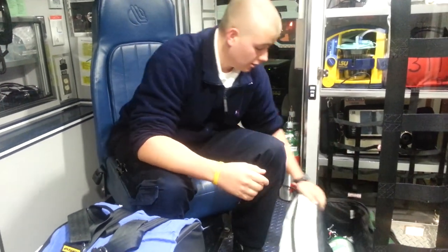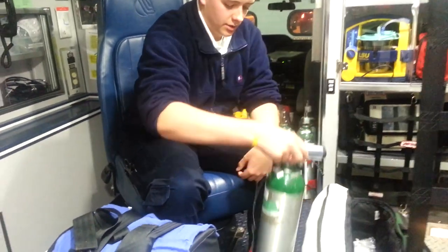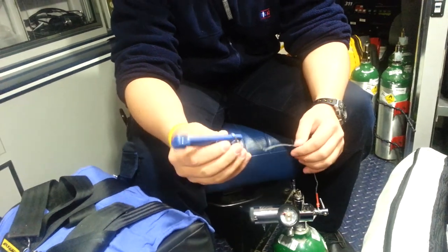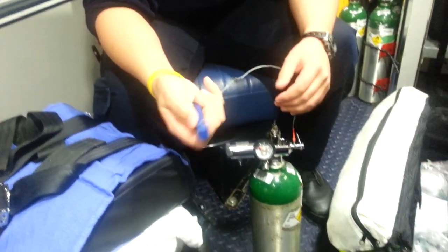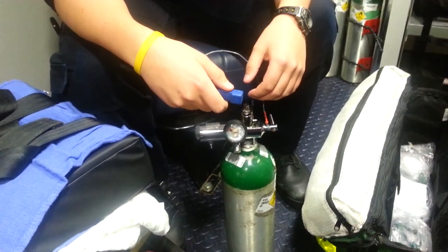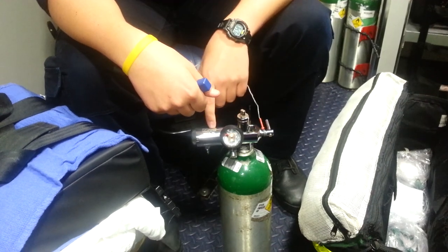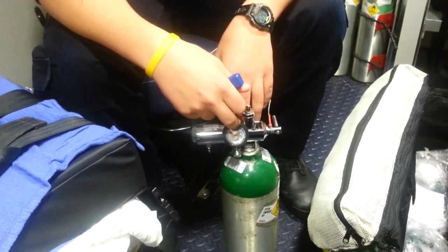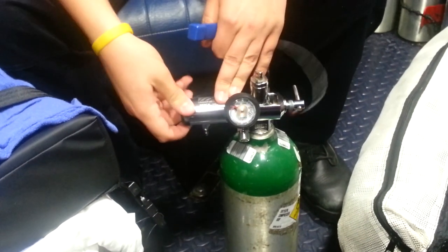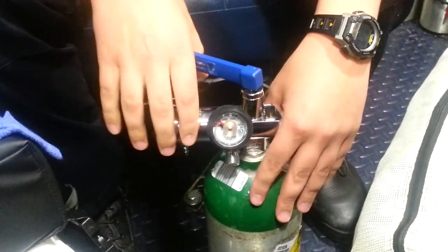So the first thing I check out is the oxygen tank. When you check out the oxygen tank, most of them have what's called an oxygen wrench attached to it. It's a wrench used to open up the oxygen tank so oxygen goes into the regulator, and then you can determine how much oxygen is still in the tank and choose how much flow there is.